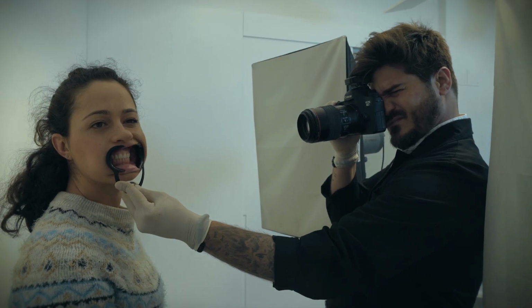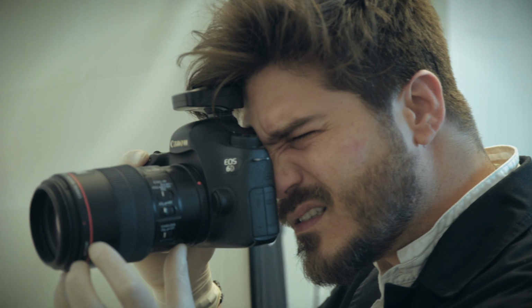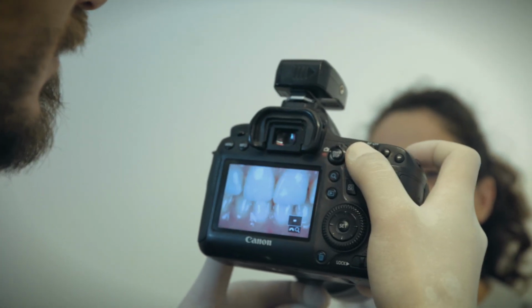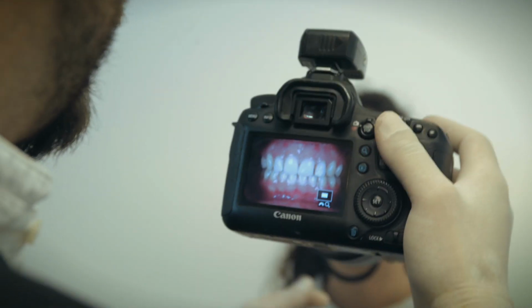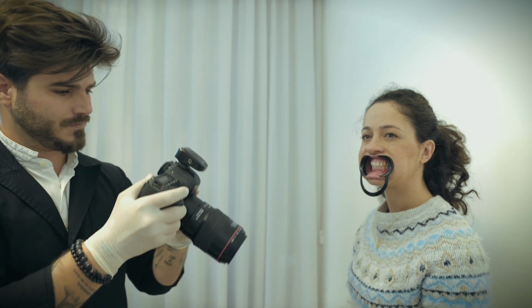Despite the importance of photos, the beauty of a smile and the dynamic integration of teeth, gingiva, lips and face are also a result from motion. Therefore, a video protocol should also be necessary. With all data collected, we start designing the smile that we and the patient pretend. So, let's do it.